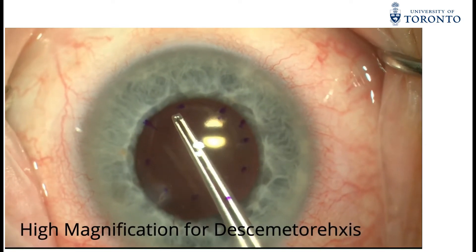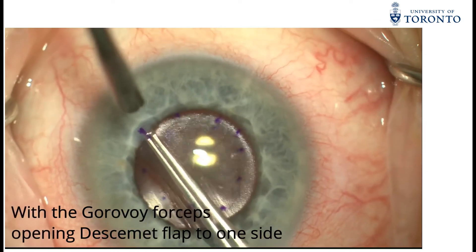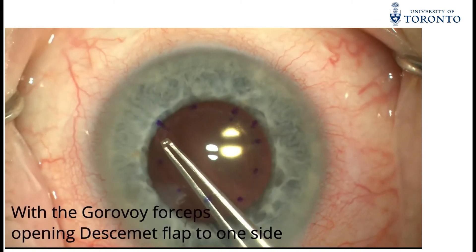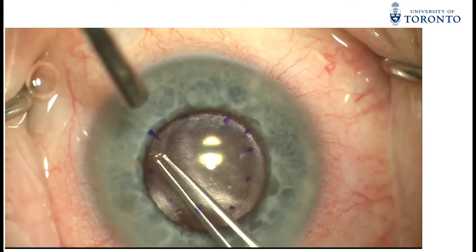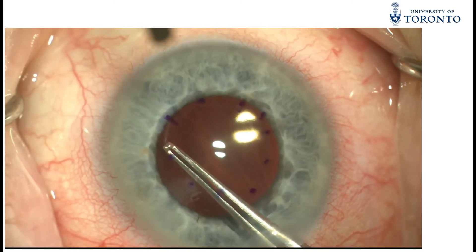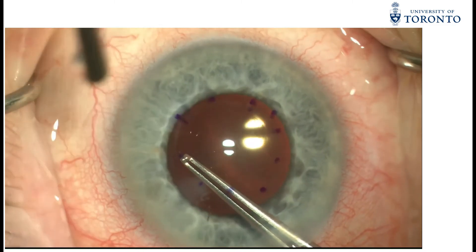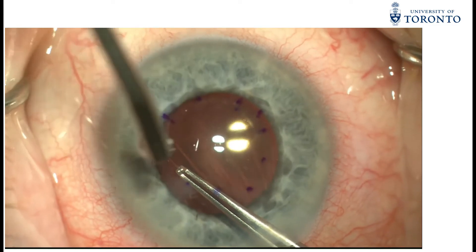The operative microscope is calibrated to high magnification, focusing on the Descemet's membrane. Holding the Gorovoi forceps closed and taking advantage of its wide and flat surface area, a linear tear in the Descemet's membrane is performed to create a Descemet's membrane flap. This flap is then extended in an anti-clockwise fashion for at least 2 o'clock hours.